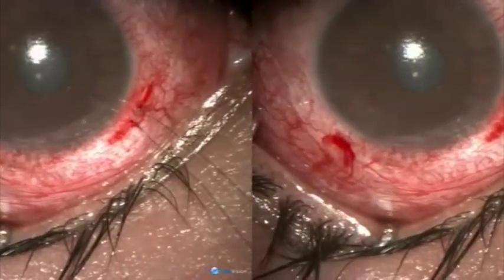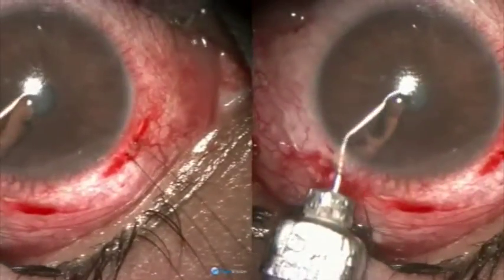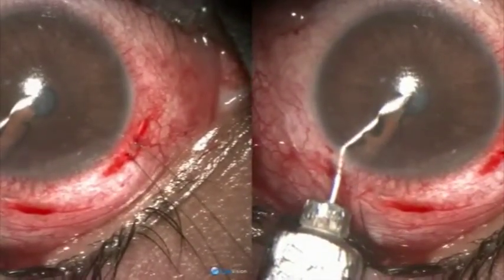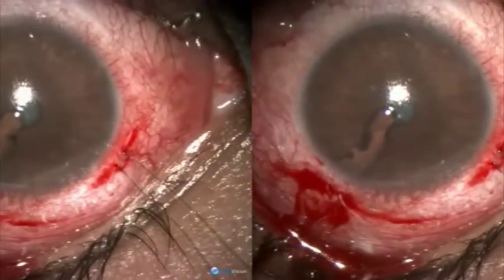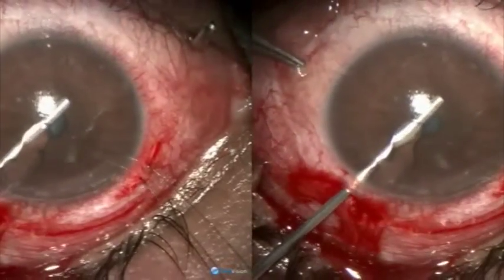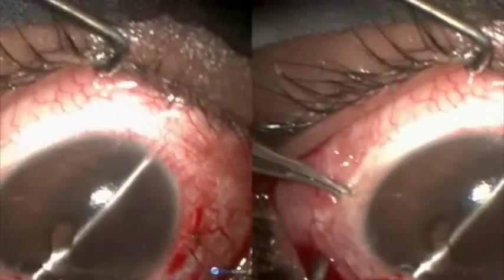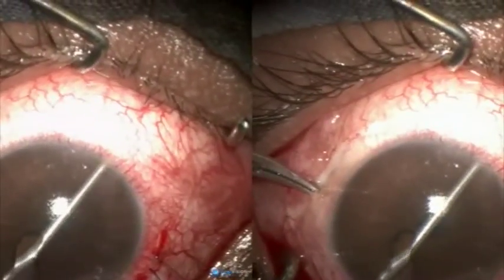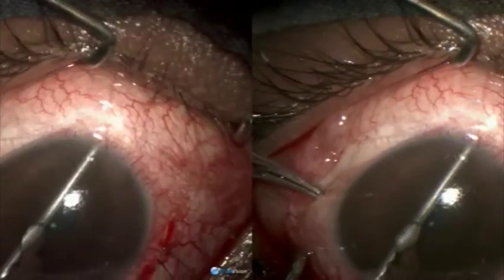Inject carbacol to contract the pupil. Put some viscoelastic to deepen the chamber. And here is a 22 gauge suitably bent cannula with a smooth tip, and we start breaking the scleral spur.